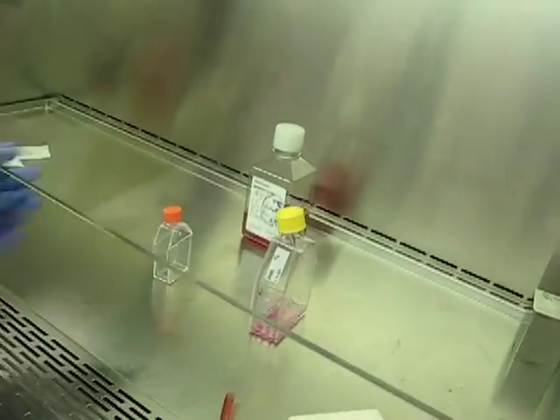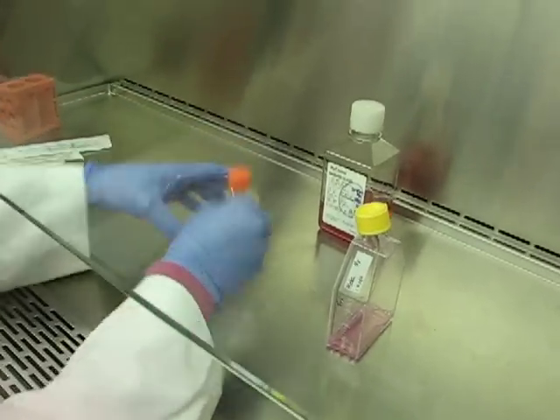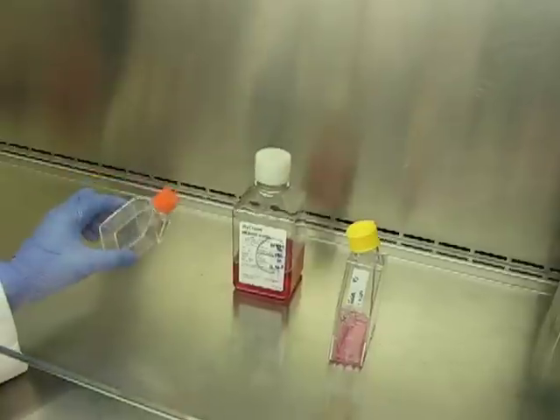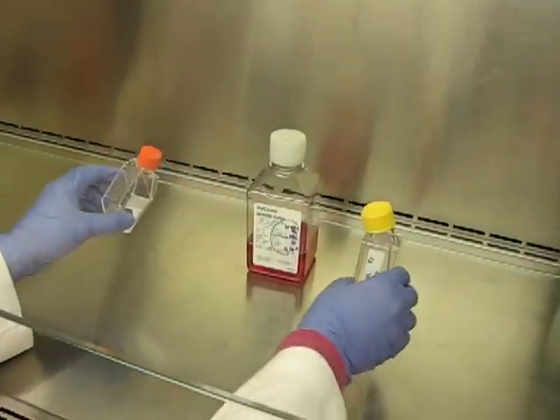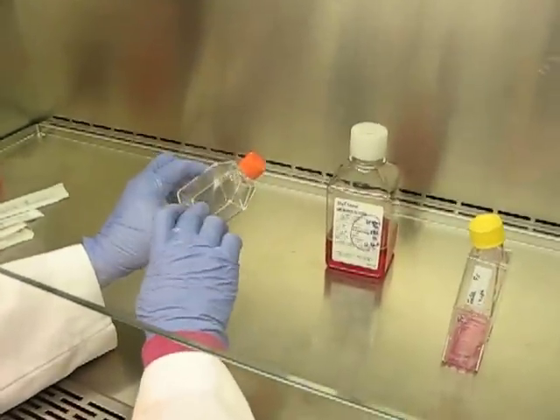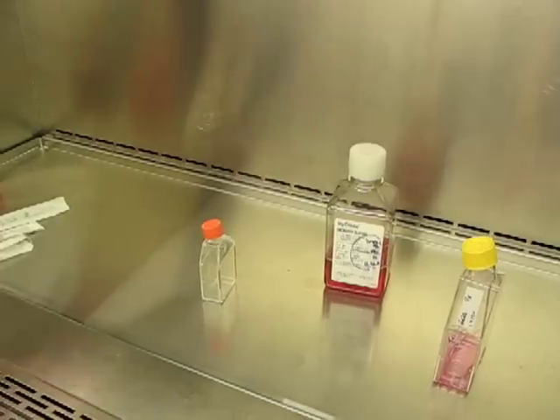I give my hands a quick ethanol. I loosen the cap of my T25 — a T25 holds about five mils of media. I've determined that I want to use one mil of these HeLa cells, which means I'm going to have to use four mils of the complete media.